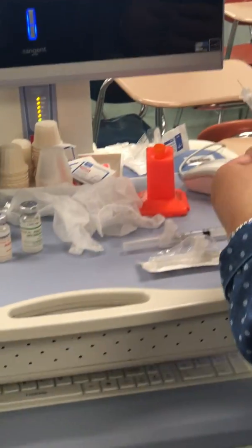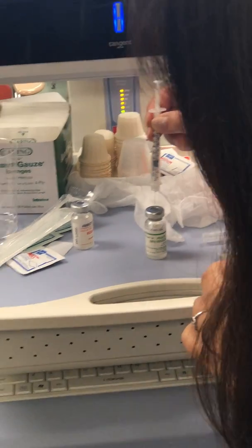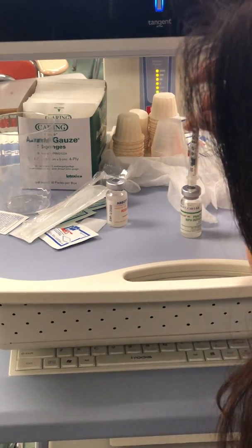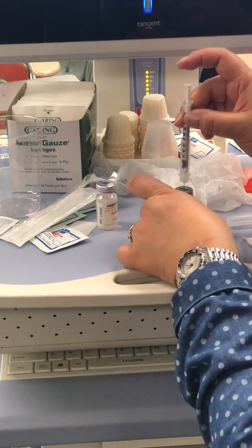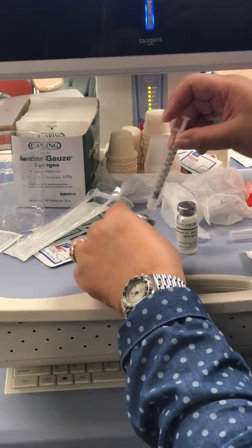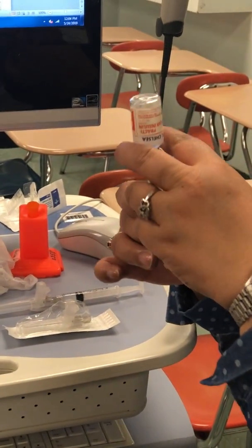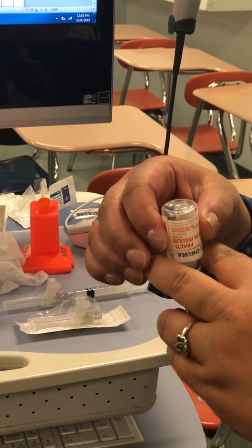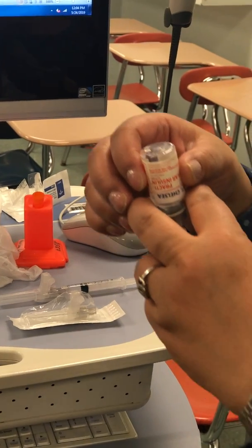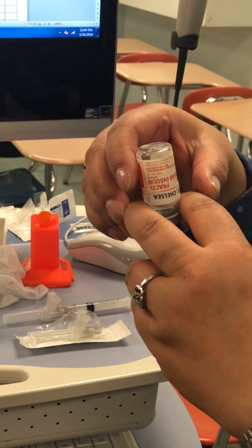We go all the way to 25. And then, did we wipe this? We did, right? Yeah. Oh my goodness. All right, so we will put our 15. We will leave 10 of air. And then we go over here, all right? Be careful because this needle is fragile and the bottle is kind of heavy. So make sure that you keep it steady and support it. If you leave it, it's gonna bend the needle, all right? So always hold the bottle.